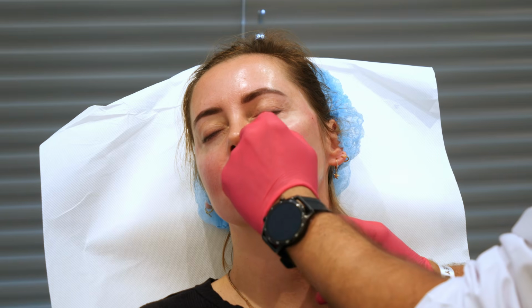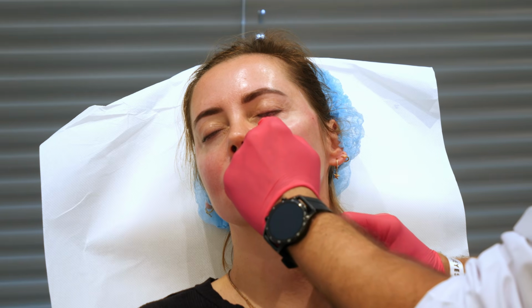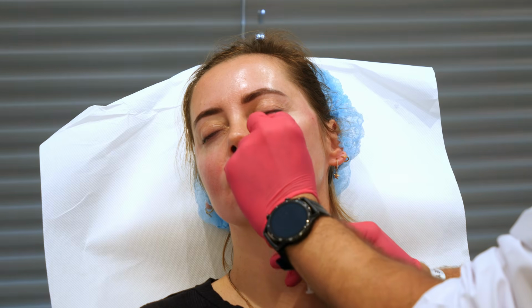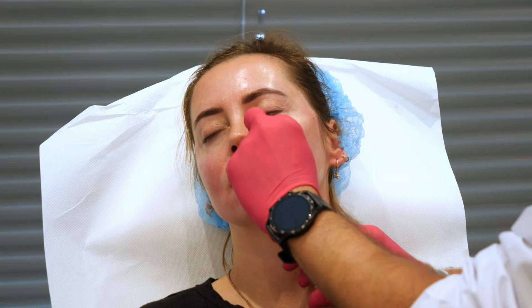where I want to put the product to correct.